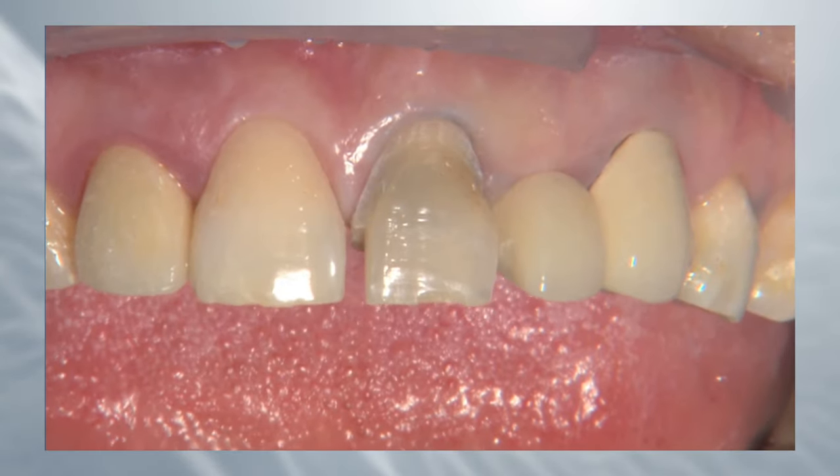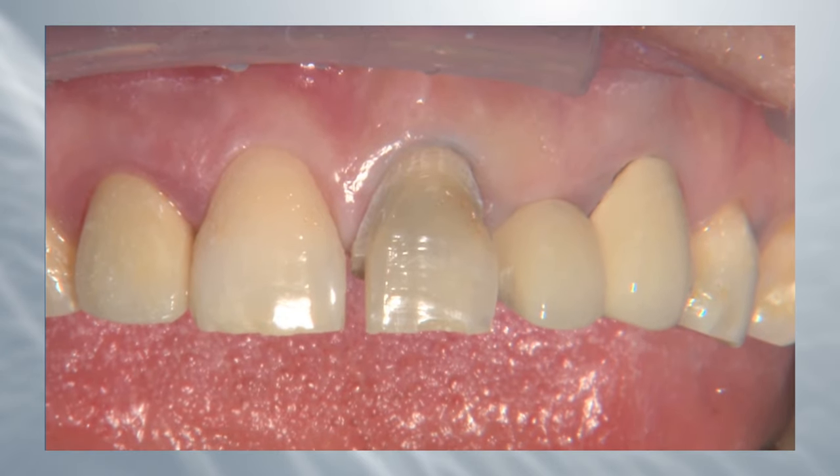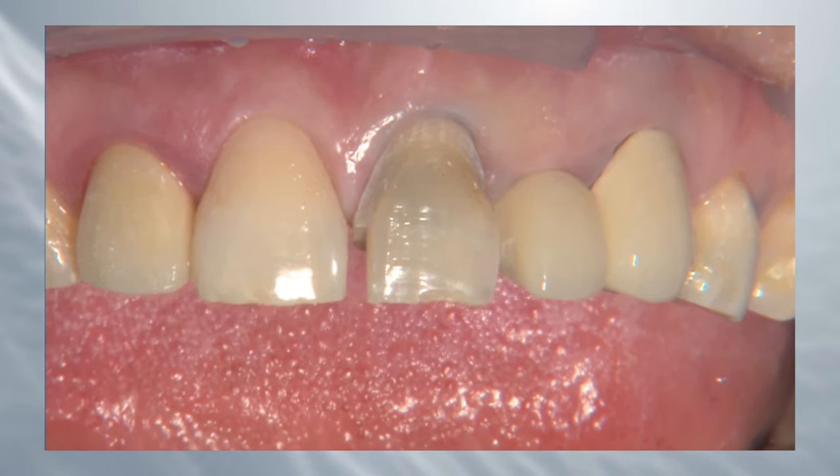When I take that cord out, the tissue is going to rebound. Now we're going to have a restorative margin that's a half to two-thirds of a millimeter subgingival, but I never had to take a burr subgingival — which would chew up the tissue and cause a lot of bleeding. So that initial cord does a good job of vertical retraction so I can prep my margin at the gingival level, knowing it'll be subgingival once the cord is removed.